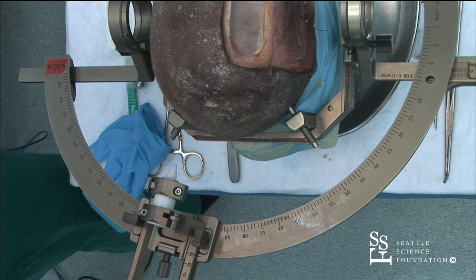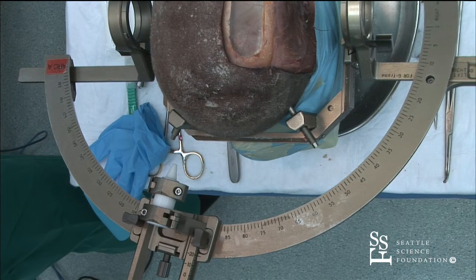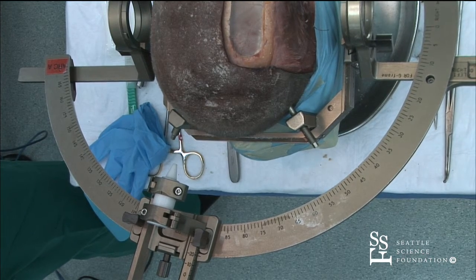So here we have our target right here in the amygdala. We're heading through the hippocampus. It looks like we're heading fairly just below the ventricle, and we can just check that going through here. We're kind of barely squeaking below the ventricle here and trying to avoid any deep sulci that have an artery in it. And so this looks pretty good as a trajectory.